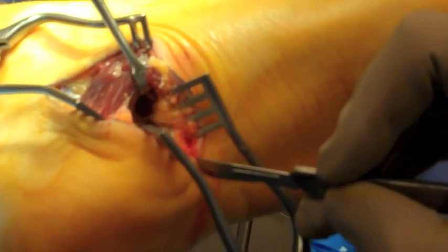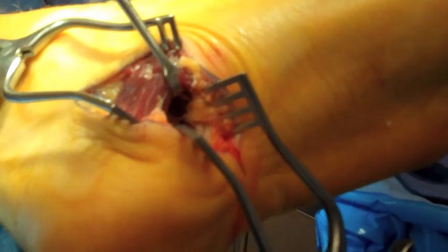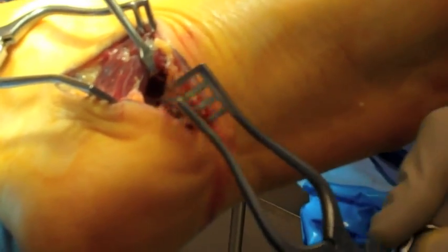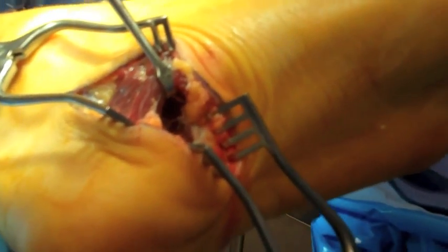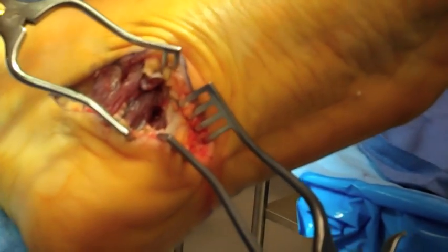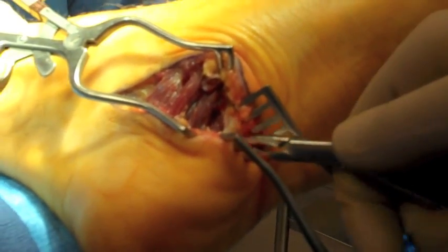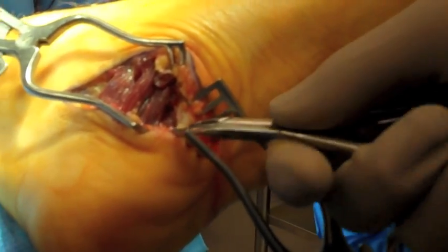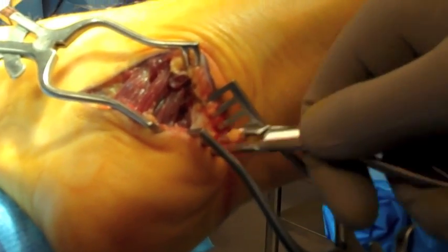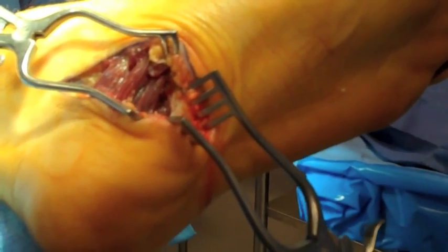The incision is lengthened along the plantar aspect towards the plantar lateral to allow complete visualization of the plantar fascia. Blunt dissection through the fibro fatty tissue is utilized to reach the plantar fascia. The Wheatlander retractors are repositioned. A plantar fasciectomy will be performed as described by Baxter in his original article to remove a section of plantar fascia of the central band. The medial band has already been released to allow for visualization of the intermuscular deep fascia between the abductor hallucis muscle belly and quadratus plantae.